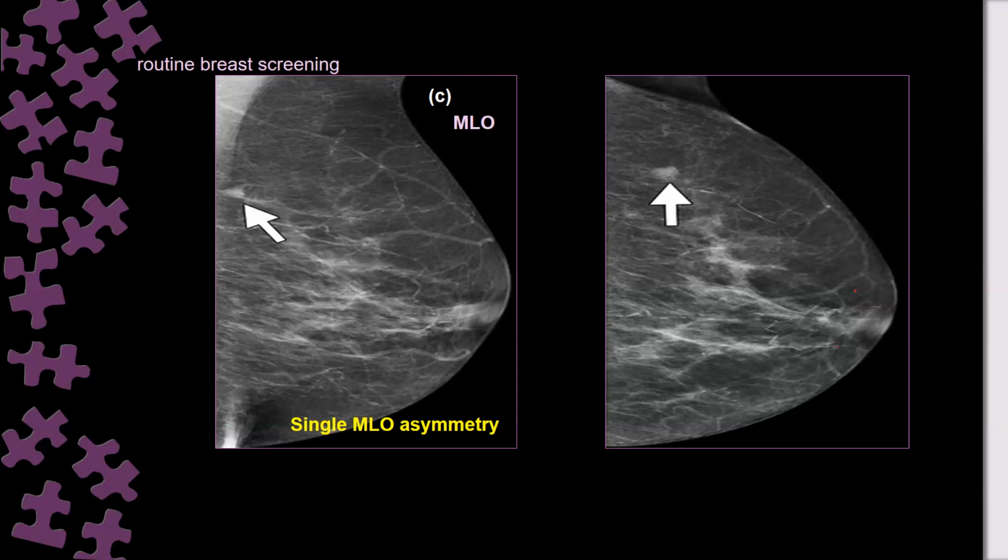I don't expect, when I have seen a lesion in the superior posterior MLO, that it is from the medial breast. Very unlikely. Most of the time, it will be from the lateral breast. I can go directly for the extended lateral view, and mostly you will see it. You got it? Yes, thank you so much.